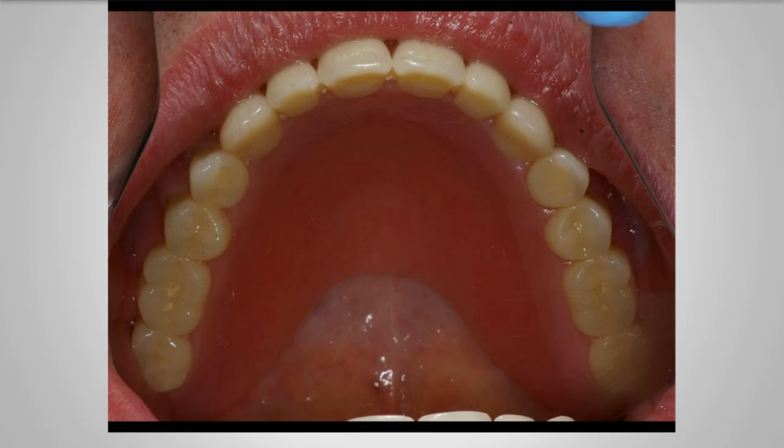If the patient chose to upgrade to a palate-free metal reinforced overdenture, we could remove the majority of that palate and do what we needed to do as far as relieving the palate. However, the one thing is, if we relieve the whole internal aspect of this palate without metal reinforcement, this denture could easily break. So what I will do is relieve some of the palate, maybe 3/4 of the way. If they choose to go with a metal reinforced denture, then at that point I will go ahead and relieve the whole denture.